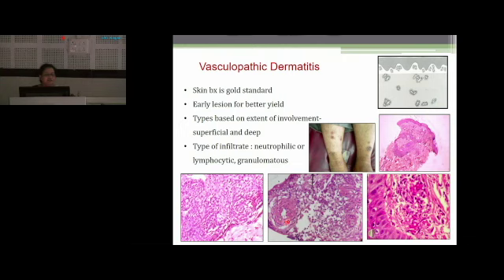Disruption of small vessels with presence of fibrinoid necrosis or inflammatory cells and nuclear debris within the vessel wall is very diagnostic of vasculitis. The histological findings along with other important clinical data, ANCA positivity data, immunofluorescence studies and other clinical information help in arriving at a more accurate and precise diagnosis of cutaneous vasculitis, or leukocytoclastic or neutrophilic type of vasculitis.